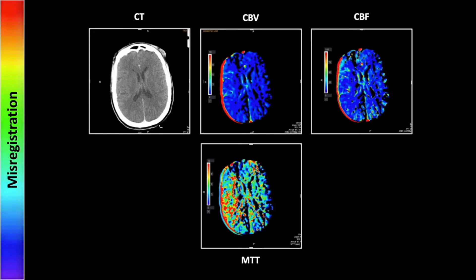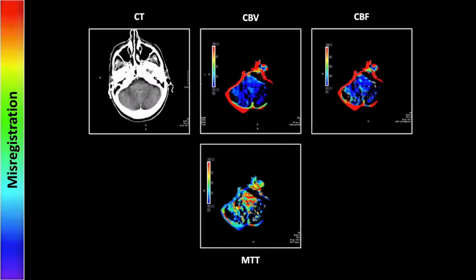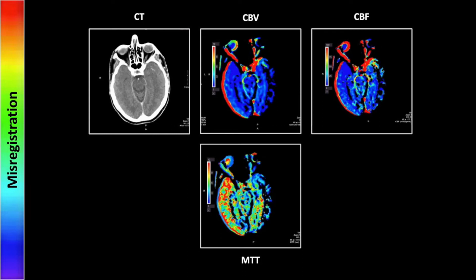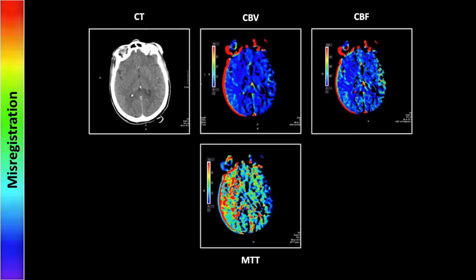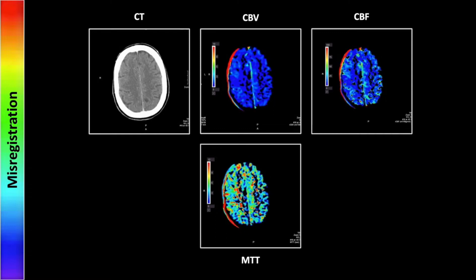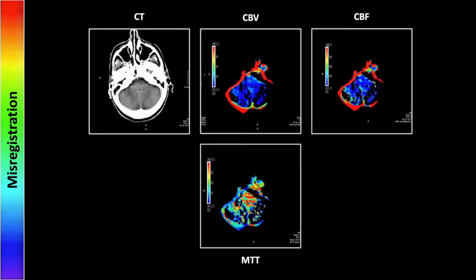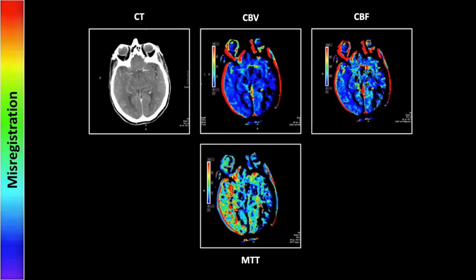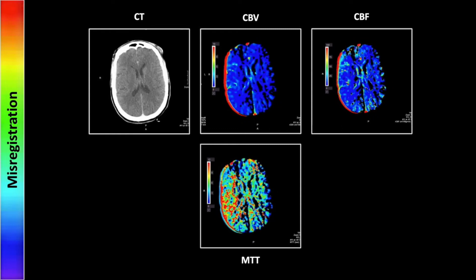Next we have an example of a misregistration artifact, which is more specific to CT perfusion. You can see that the color maps have been superimposed on the anatomic images in such a way that they are offset, and obviously this has to be given a more nuanced interpretation as well. Similar to the motion artifact, you can see that these involve every image in every set. So that is a case of misregistration artifact.